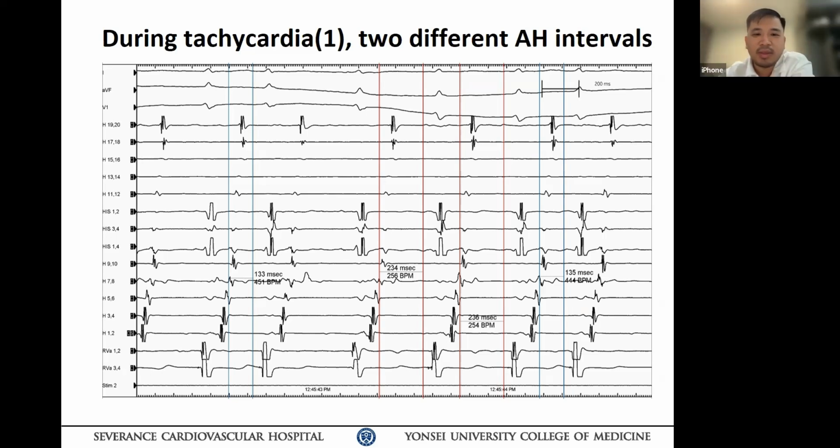Yeah. Here we saw only cases like this, an eccentric accessory pathway, and after the delta wave is gone, sometimes there is dual AV nodal physiology but not inducible. That's the case I see in Cambodia. I think we can invite Dr. Chen Huang to listen to his experience.